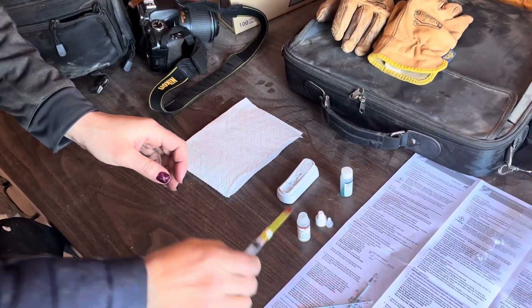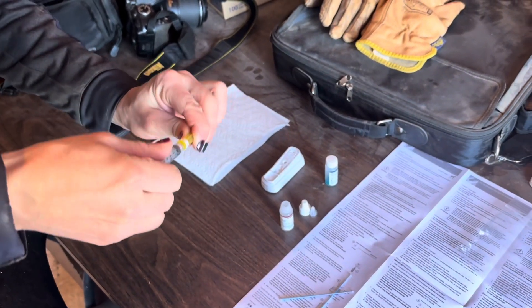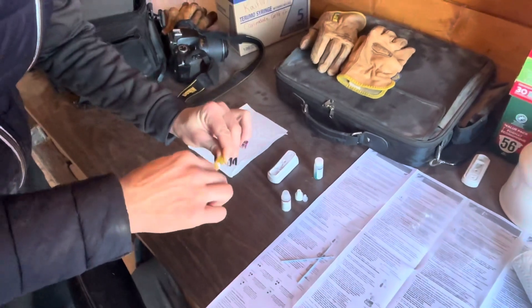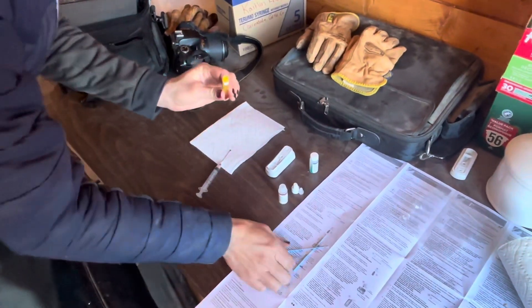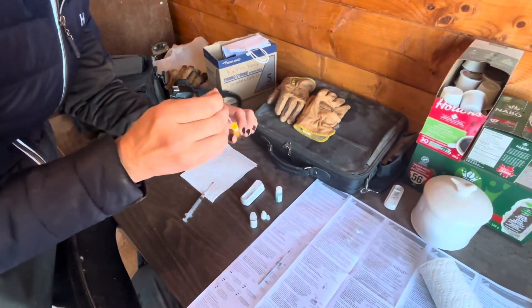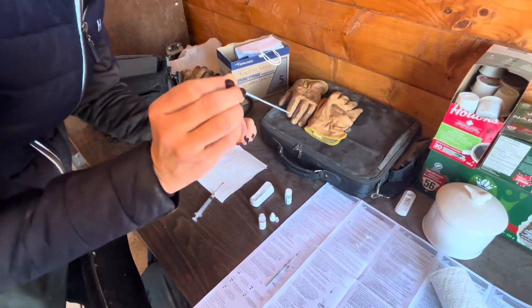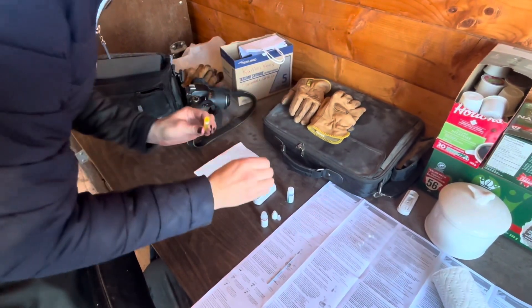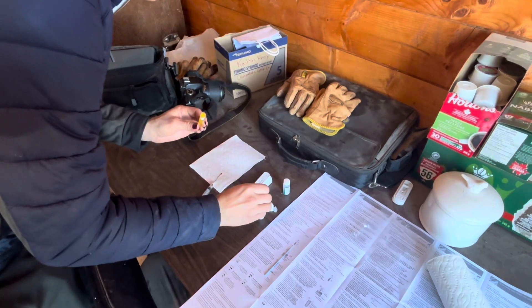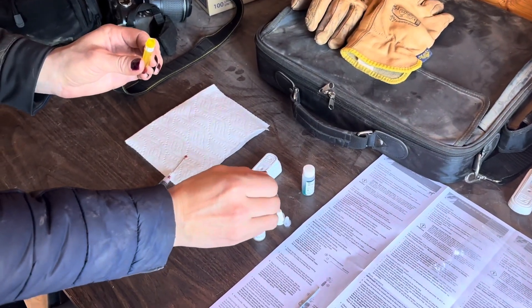We're using fresh blood that we just drew, so you're gonna need two droplets of the blood. We're gonna take it from inside the cap here — you've got these tiny little loop droppers. We're going to use both of them, so we're gonna just dip just the top in to fill that little loop with blood, the tiniest little bit, and you're gonna put that into the solution and swish it around, make sure that it clears out of that loop.